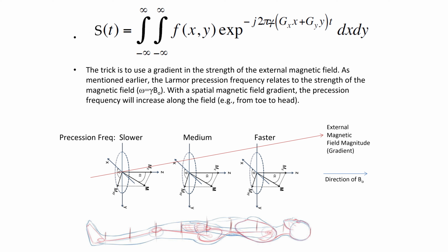Now, the T1 signal is kind of like I punch the singers in the gut with a radio frequency pulse, and it knocks the breath out of them. The time that it takes for them to recover their breath is sort of like the T1 signal, the time to realignment with the main magnetic field. And again, the frequency, the note that they're singing, would represent their position.